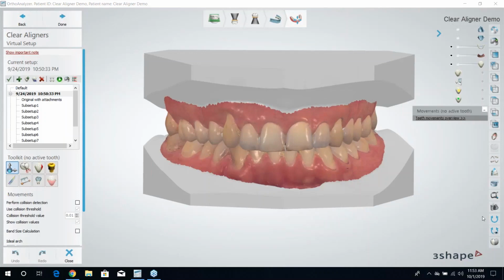What is the cost of the Clear Aligner Studio? That's a good question. Actually, I don't know because I don't sell the software, I simply support it. That's something we can talk to Chris about. You can email me, or email Chris Fry. My email address is just my initial, bhiller at whitmix.com. You can also get in touch with Chris Fry, which is CFRYE at whitmix.com. He can get you a quote on it.